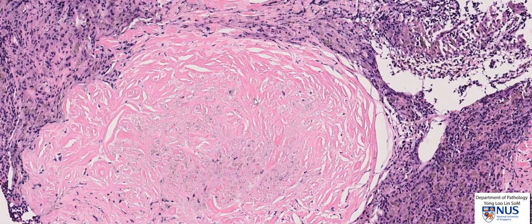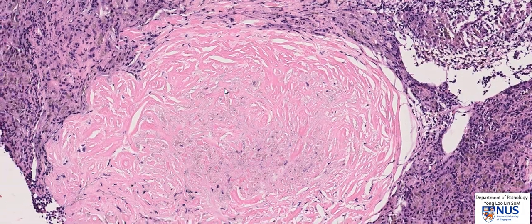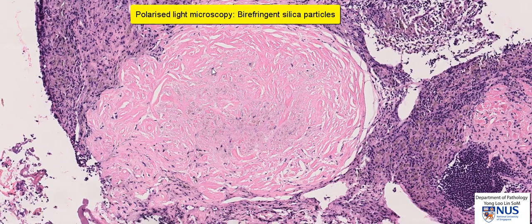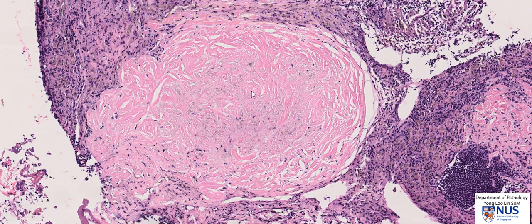One interesting feature is that if we were to perform polarized light microscopy, we would be able to see birefringent silica particles. So this dense collagenous appearance is very classical for silicosis.